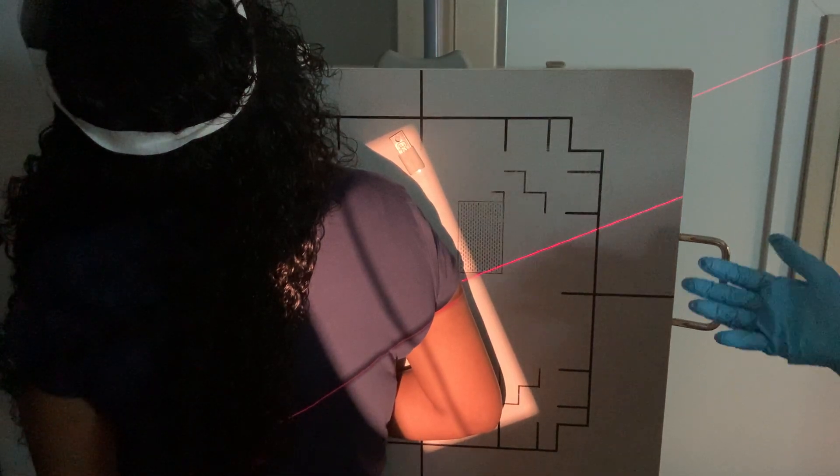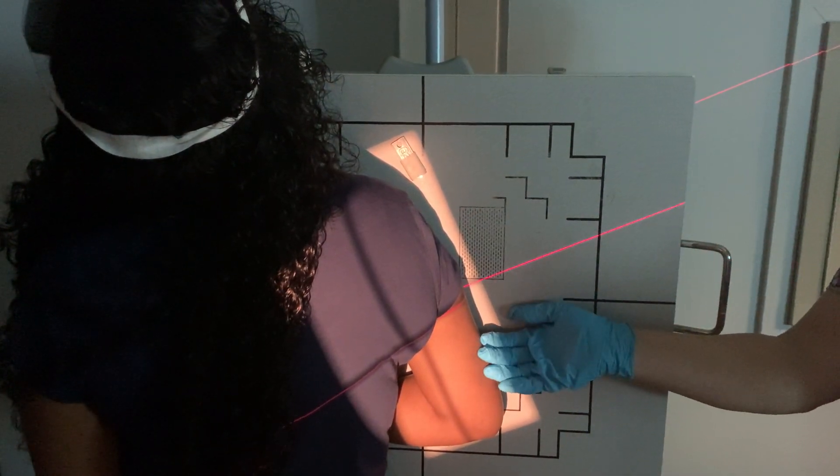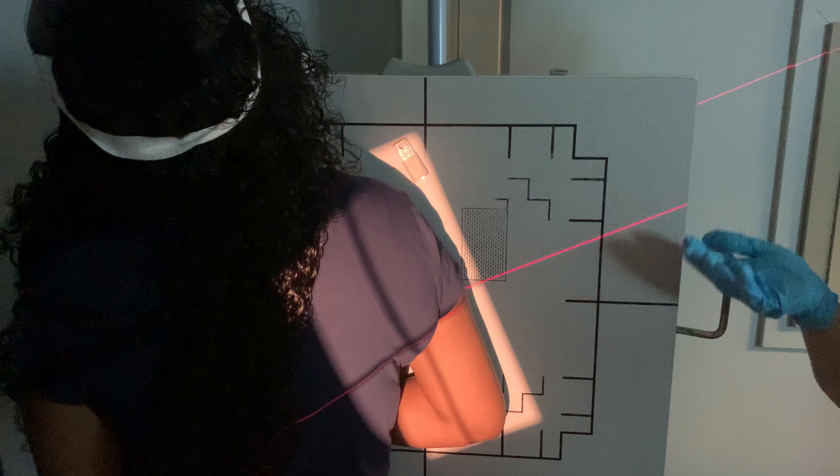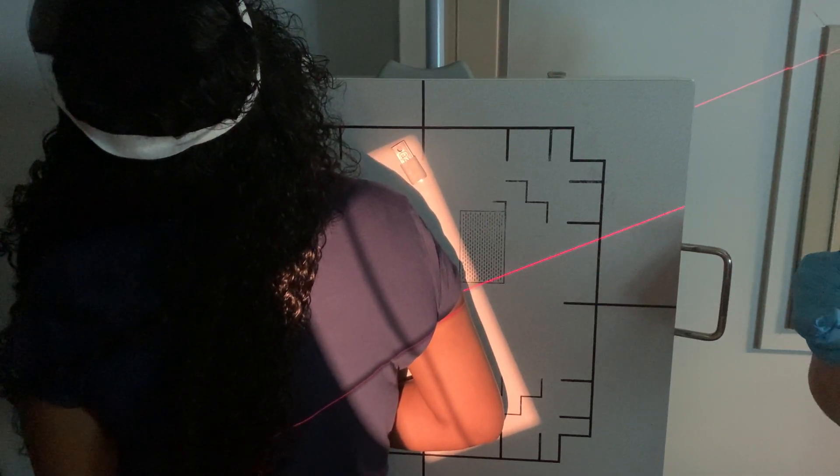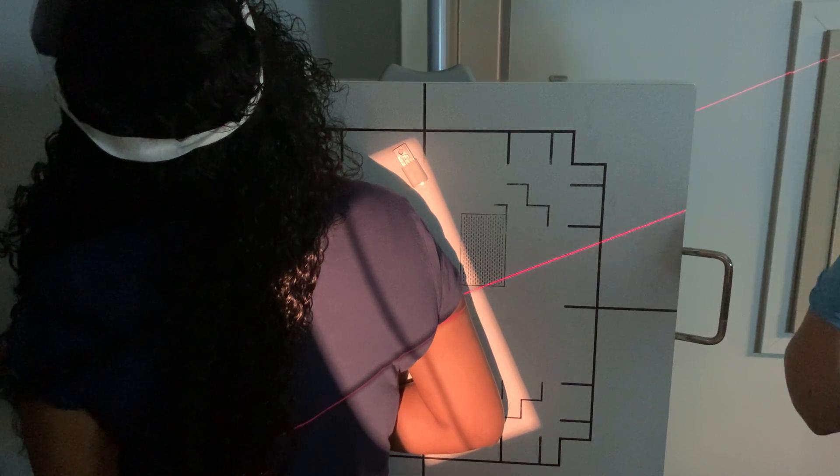You can do lateral upright — you can do them PA or AP. A lot of techs prefer to do them this way; they like them better. It's up to you. Whatever your patient can do and whatever gets your part closest to the IR.